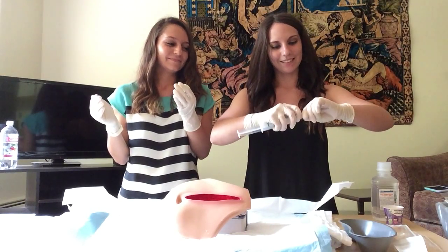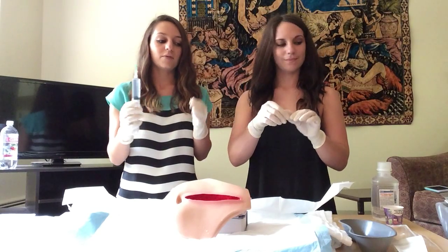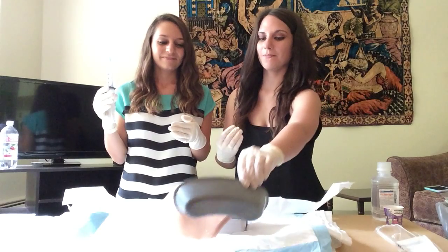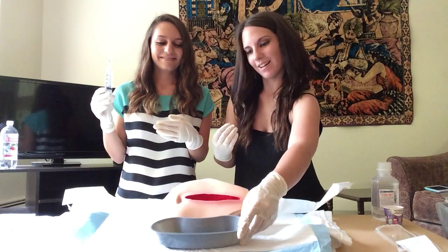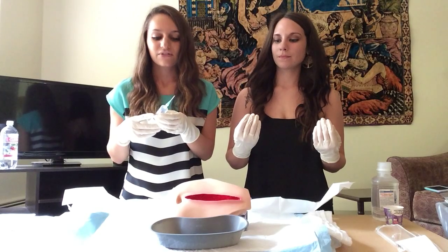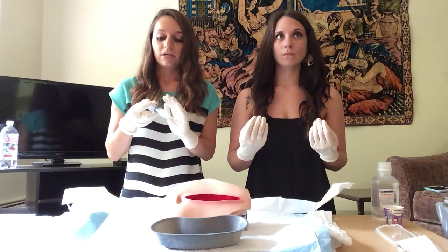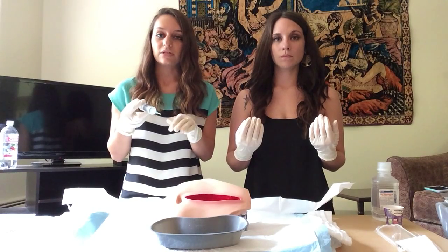Now that the syringe and catheter tip are connected, I'm noticing I forgot to place the emesis basin underneath the wound. So the assistant will use their non-dominant hand to place the emesis basin — that hand is now contaminated. Now we're going to start the irrigation. Starting from the cleanest area to the dirtiest, we work from top to bottom. We continue until either the syringe volume ordered by the physician is used, or the drainage coming from the wound begins to turn clear.